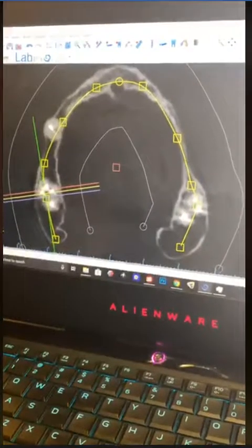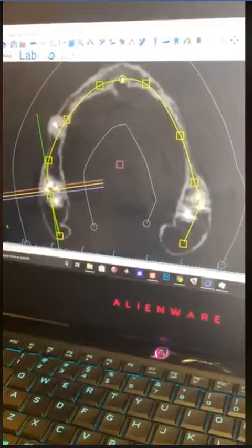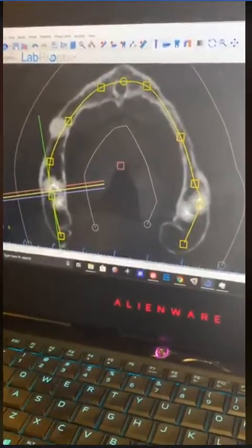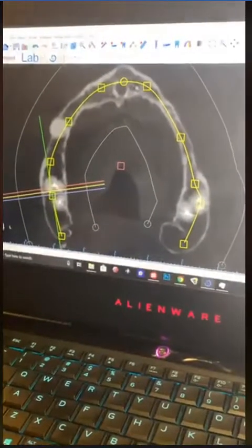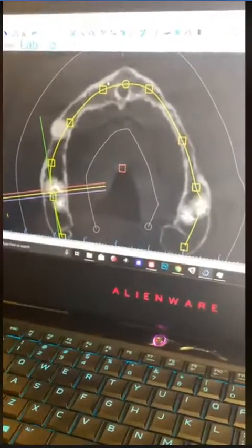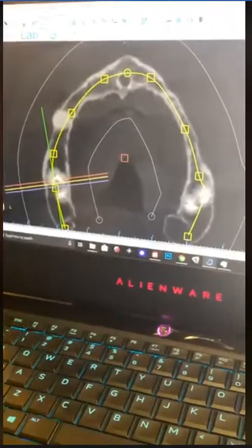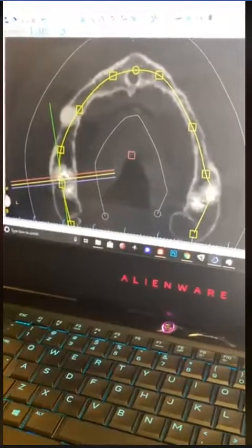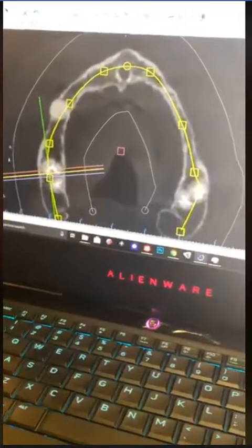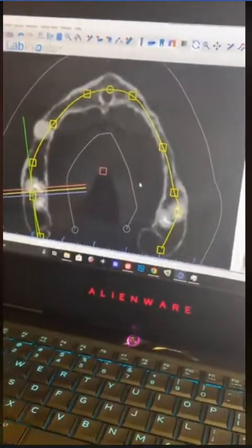Look how thin. The patient has a tooth here, there's a tooth here, there's a tooth here, and then there's a couple of teeth in the anteriors, 8 and 9 and 10. But you see how you have bone here? The bone in this area is simply due to having the teeth in this area. You have a little bit of bone here, but that's only because this tooth is there. These two, number 2 and 15, it's only because these guys are there. So he wanted to take out all the teeth and insert a denture in its place, okay?